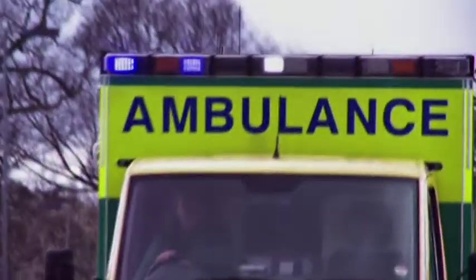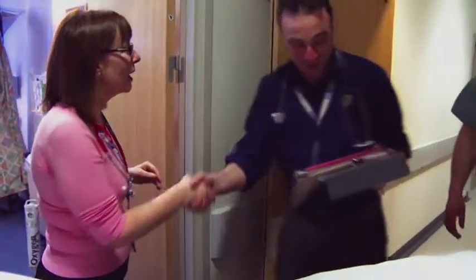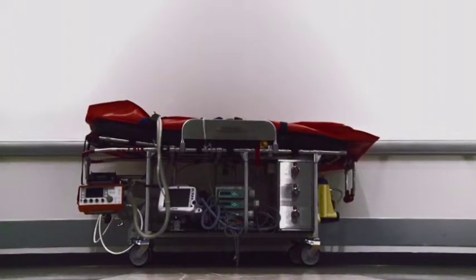Transferring a critical care patient takes teamwork, experience, good communication, and a knowledge of the correct procedure. The most important component for a safe critical care transfer is the critical care transfer trolley itself. This should be checked by a trained nurse at the beginning of a shift. It should also be checked upon return from a transfer by a trained staff nurse.